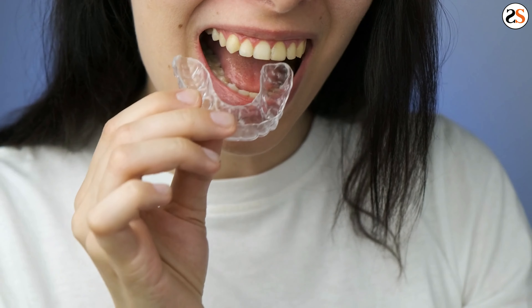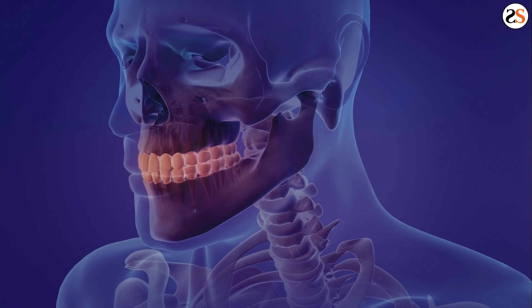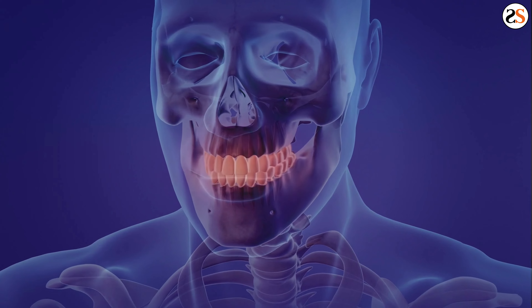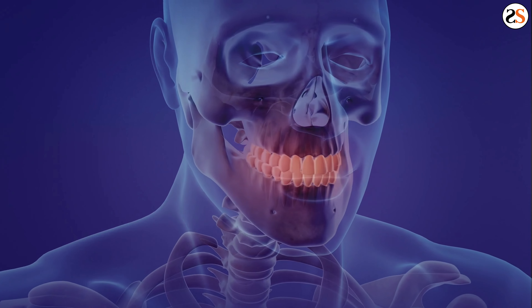If you have an older retainer, the material may be breaking down, resulting in rough or sharp areas. If you start to experience regular canker sores in your cheeks or gums, you may want to examine your retainer for rough spots. It may just be time to replace your retainer.